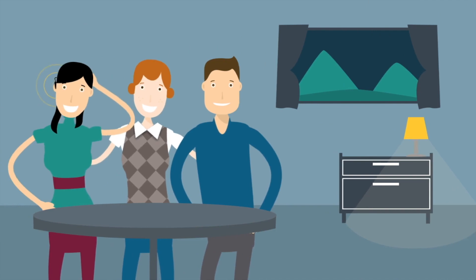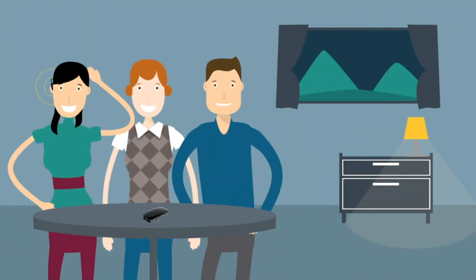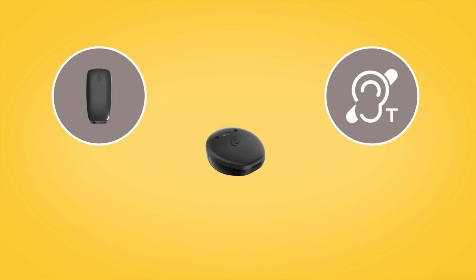If you have a Mini Microphone 2 Plus, you can place it on a table to listen to multiple speakers in a group setting. If you have a Kanso 2 sound processor, you can also use the Mini Microphone 2 Plus to access Telecoil for room loop use.